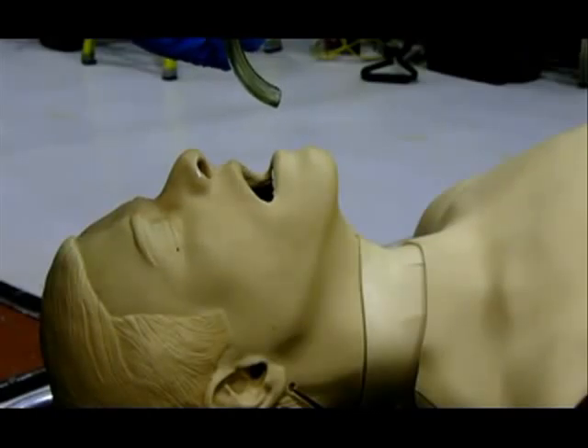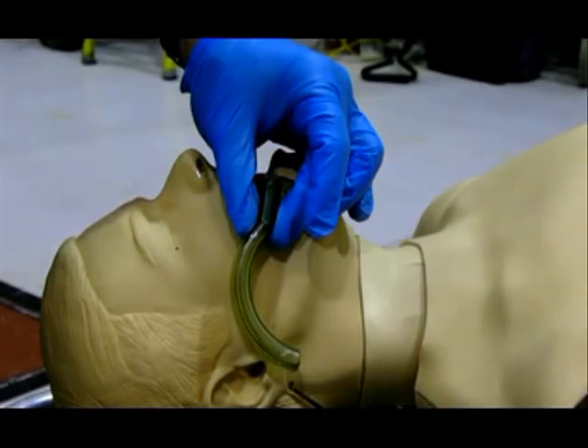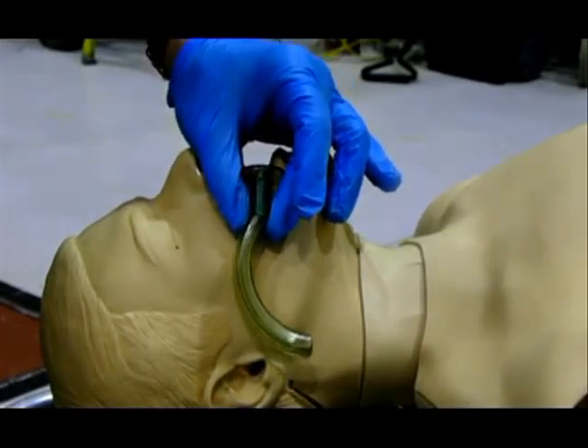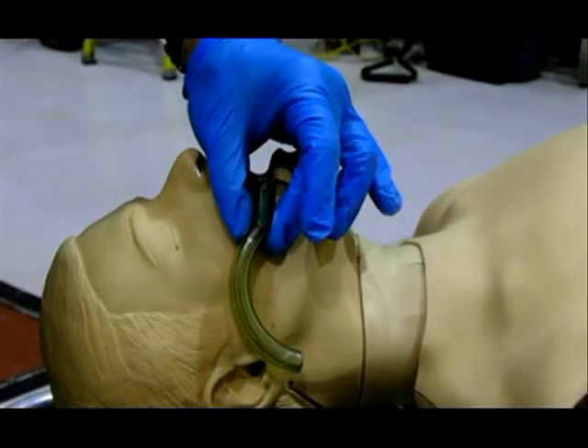Sizing of the OPA. OPAs come in a variety of sizes to fit almost every patient. The important thing to remember is to know how to properly size an OPA for optimum fit. Place the adjunct on the patient's cheek with the flange parallel to the corner of the mouth, which is generally equivalent to the lateral incisors. The tip should extend to the earlobe for a proper fit.